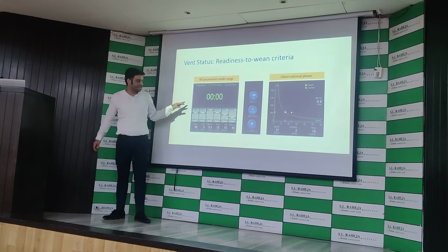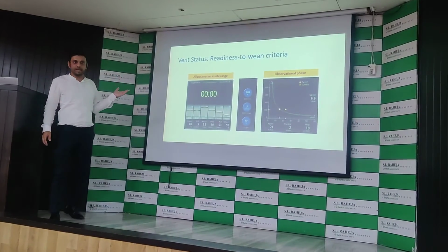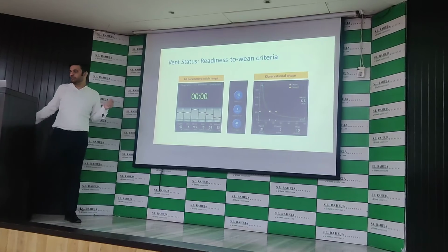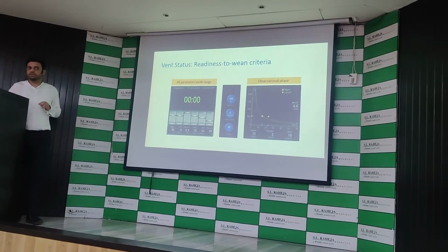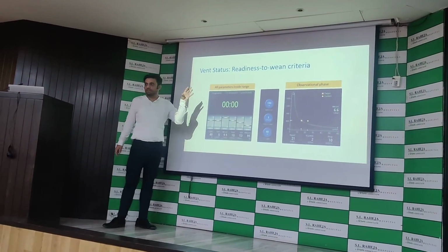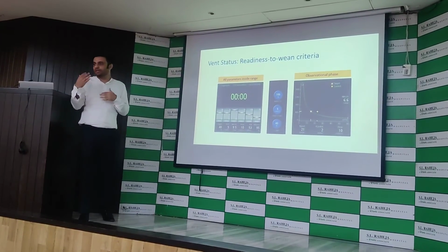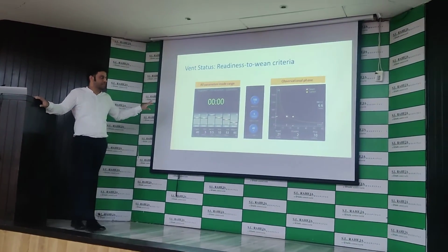So exactly when it comes to this, it starts the SBT automatically, and then it will run for around 30 minutes. After that, it can give a status message that says consider extubation. But looking at other criteria, of course, like tube obstruction, secretions, fever, and other things, you will anyway have to see, even if it is in this state.